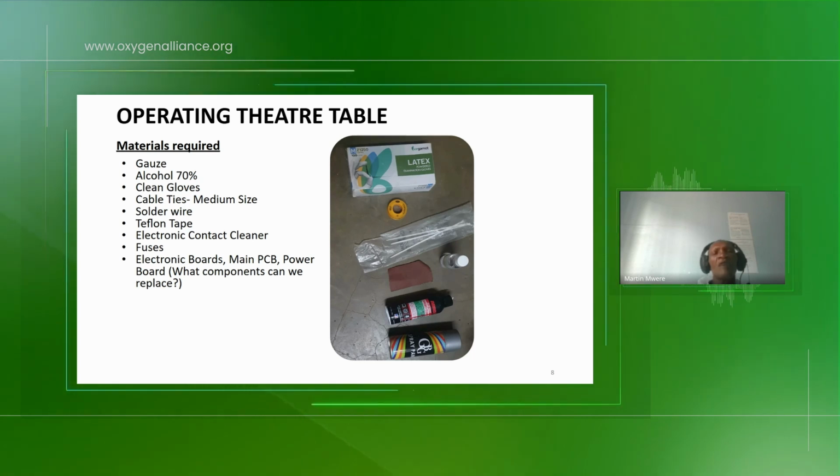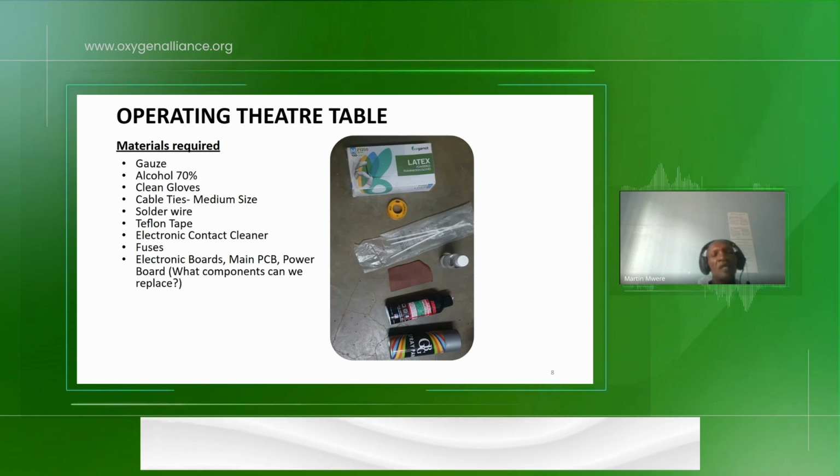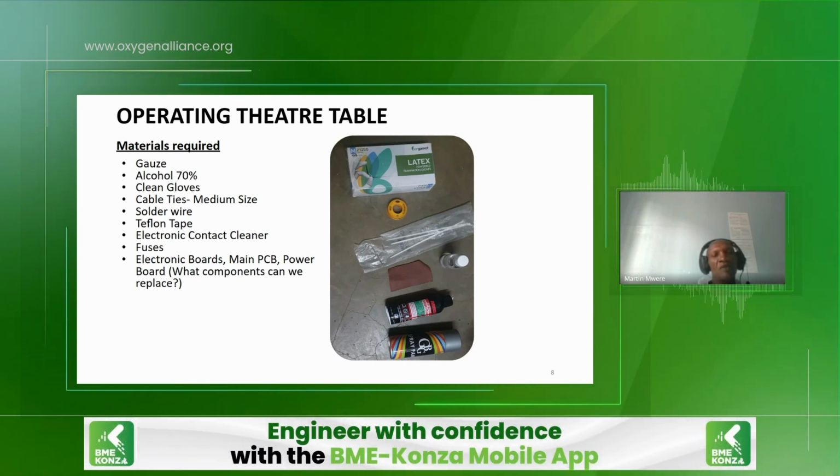You need to have a set of fuses, different fuses, depending on the current. As an engineer, you need to carry several fuses.